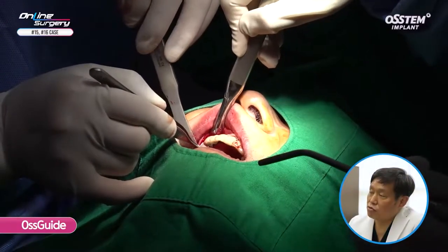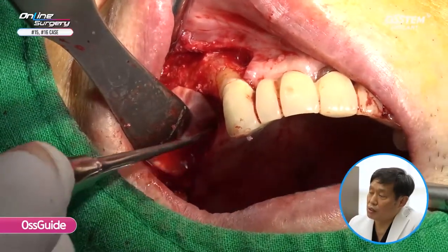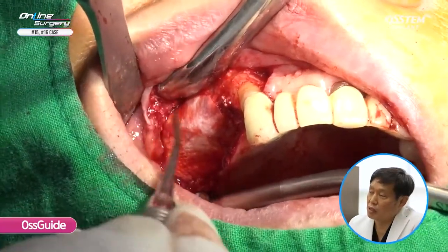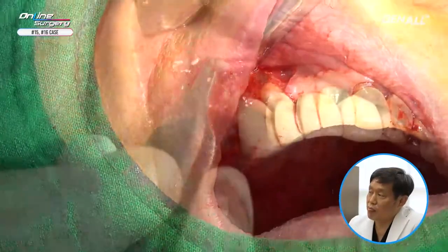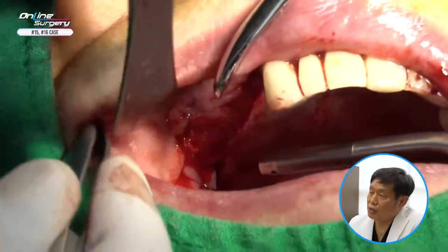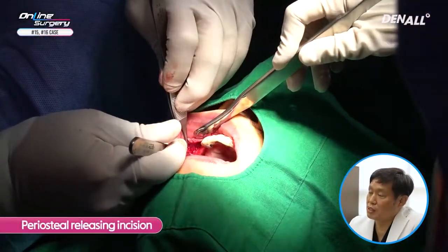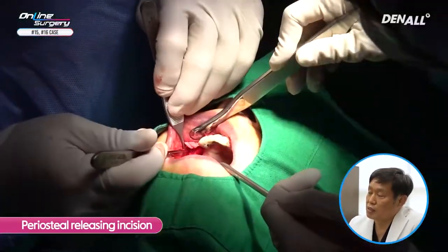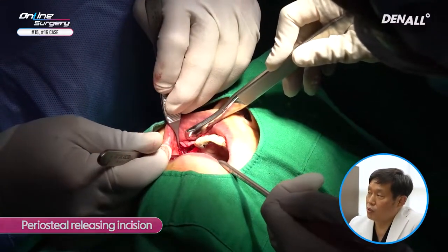You need to irrigate using saline water. You put it below the palatal flap. Especially for number 16 where GBR was done, the OssGuide is used. A collagen membrane is used for coverage. The flap is being pulled on the distal side. Because we did augmentation, we can see it's quite lacking. A periosteal releasing incision is made. You can see that the flap can be closed tension-free.